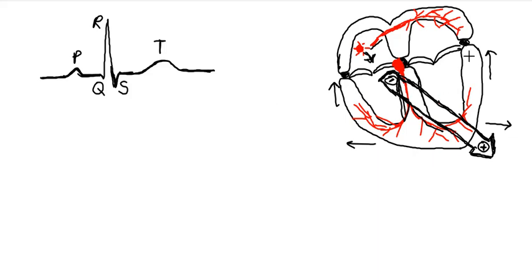These are basal segments, and here the impulse is traveling in a direction opposite to the cardiac vector, and thus it is producing a negative deflection and a negative wave. Now the heart is completely depolarized, meaning no electrical transmission. Thus the heart is electrically silent again, and we have the ST segment, which is isoelectric because there is no current transmission and thus no deflection on the ECG machine.